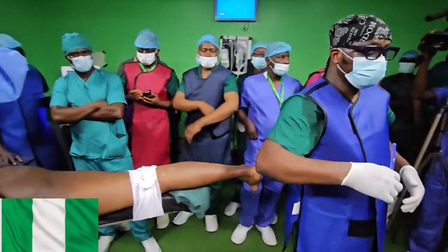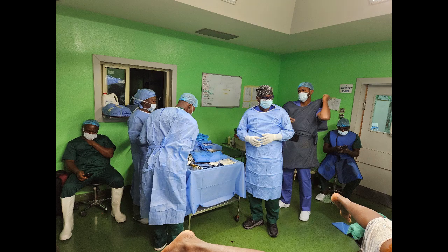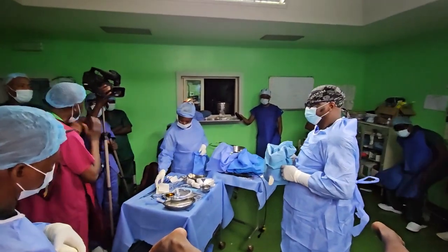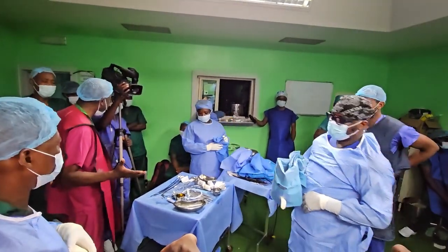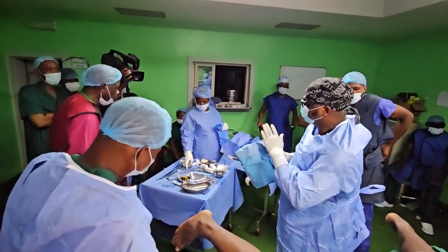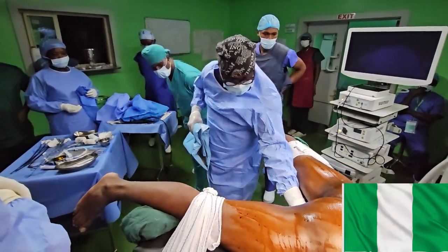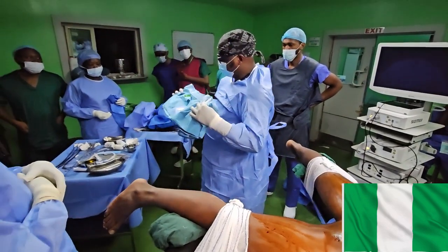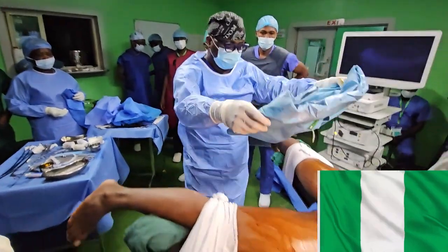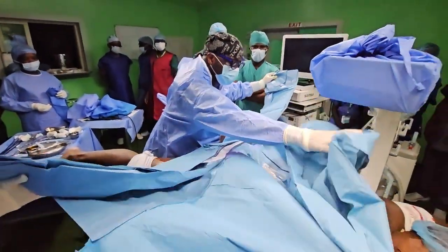There are some special PCNL drapes. Yes, there are PCNL drapes. Please go ahead. Yes, so we are about doing the draping. You can see we have to insert the star drape underneath to shield the phallus, to bring the phallus out, so that we can access it without contaminating ourselves. So this, the TUR drape, the arrow is pointing up, so you place it this way, so that you know, this goes this way. Just hold on, we need to adjust.